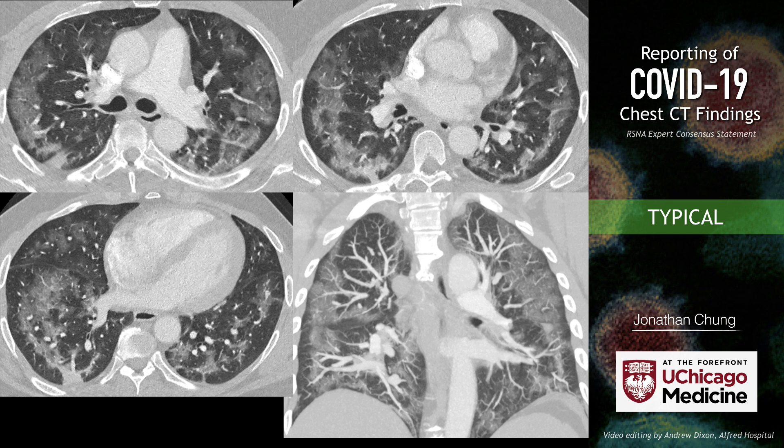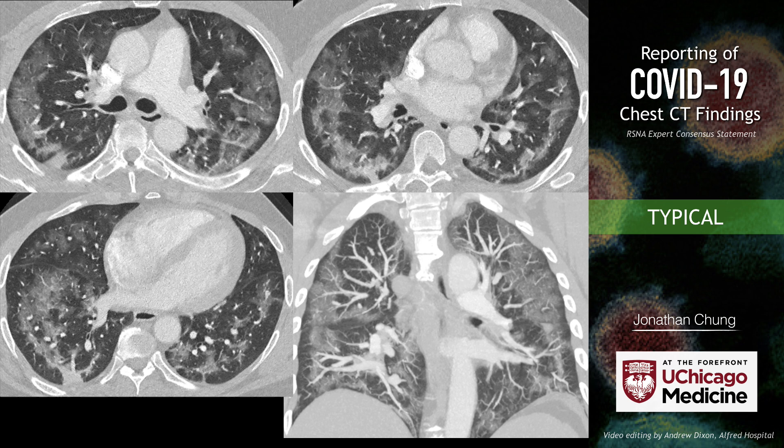Here's an example of the peripheral ground glass opacity we see in patients with COVID-19. This does have maybe a little bit of a basilar predominance, though that is not part of the consensus statement. But certainly peripheral, certainly ground glass, certainly bilateral — so this would be highly consistent with COVID-19. Here's an example from the Radiopaedia case file. Ground glass opacity in the lung periphery in a patient with suspected COVID-19 infection — this would be a typical imaging appearance.